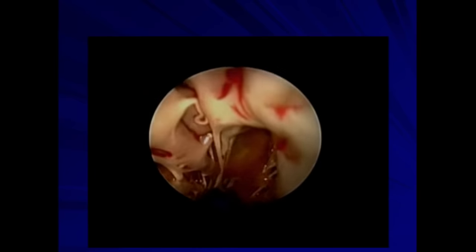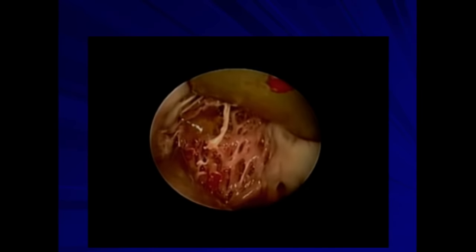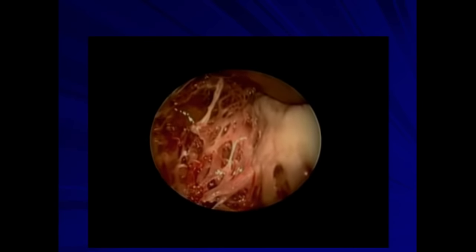And you can see it's that little yellow mucoid thing that's behind all these trabeculae way up there in the apex. I think what was really evident from this video is that mass was very strongly adherent to those trabeculae, so it probably wasn't going anywhere. Because it takes them a long time to free it up and dig it out.